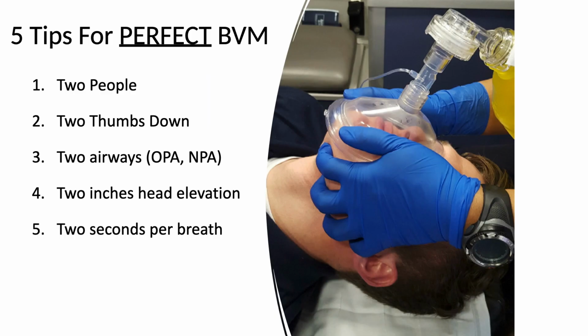And one of the ways that we actively control an airway is with a bag valve mask. And this, I would argue, is a much more important skill to be able to do than the act of actually intubating, because you can manage most airways with this without having to actually visualize the cords. If you are very good at this skill, you can absolutely save a life and be able to oxygenate and ventilate someone for quite a while. So I would encourage you to practice this skill when you get a chance and become experts at it. It's absolutely very important to any practice of pre-hospital medicine at any level.